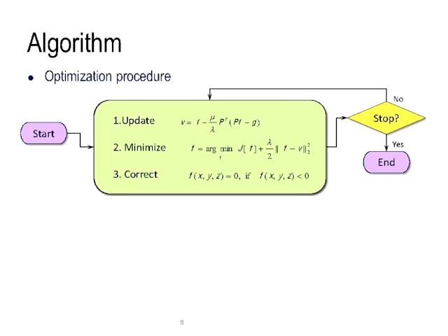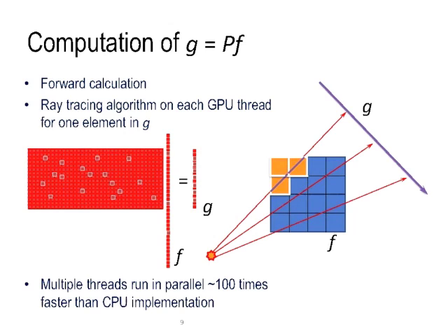If some volume is calculated as less than 0, it doesn't have a physical meaning, so we just set it to 0. So we see three variables are involved in this calculation: the transient CT volume F, the projection variable, and the two-dimensional images. These three are juggled to be calculated through this step.